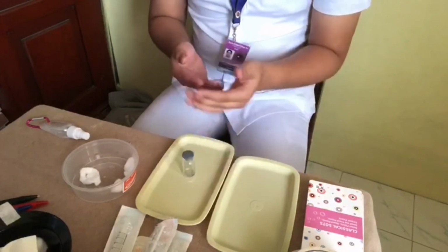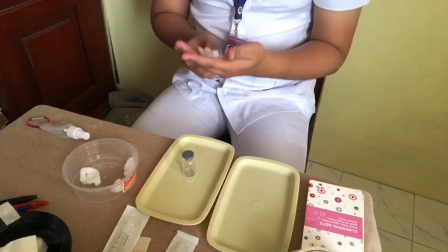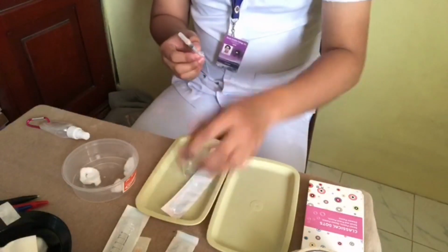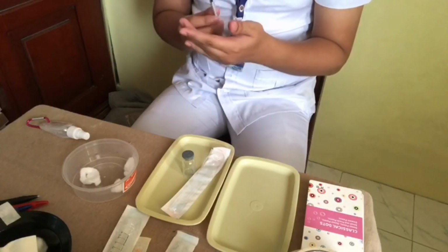Here we have a syringe with a needle attached. We'll carefully remove its cap and then draw up air with an amount equal to the volume of the medication to be withdrawn.